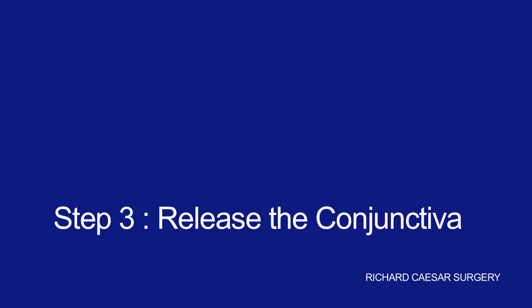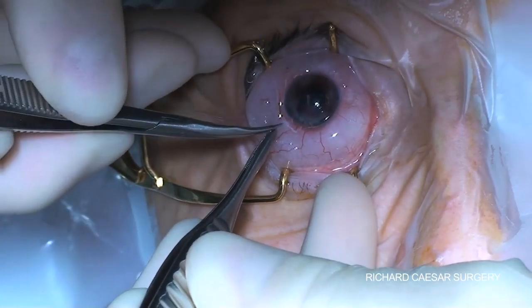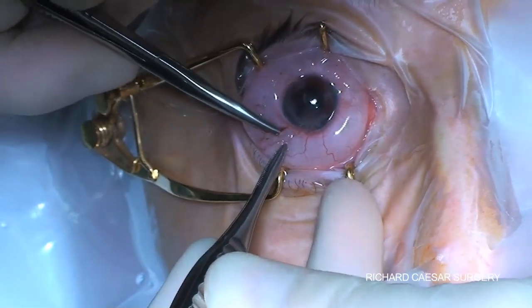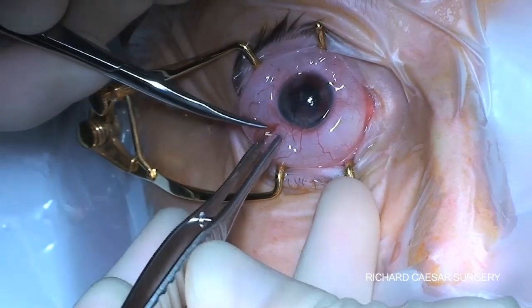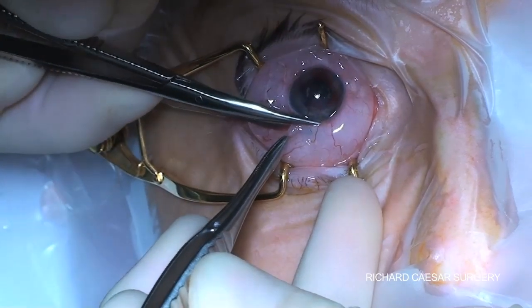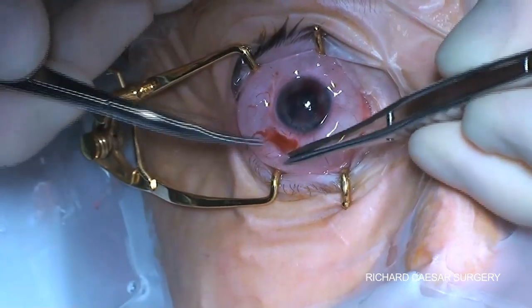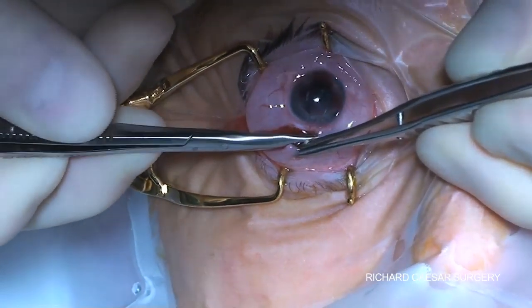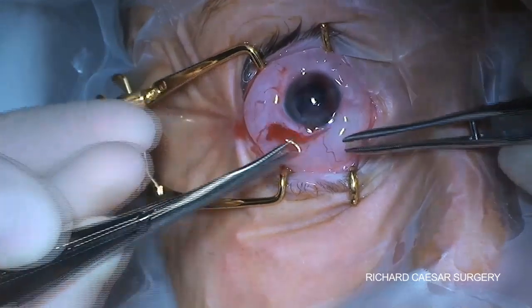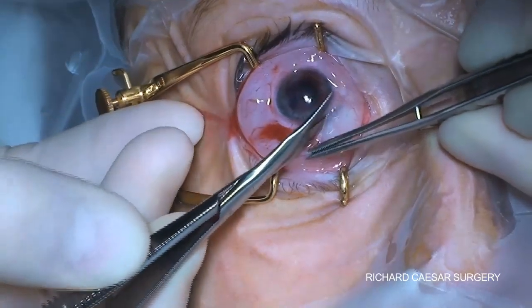The next step is a conjunctival peritomy, exactly as you would do for vitreoretinal surgery in terms of hooking the muscles, or indeed for squint surgery. A relieving cut is made. I like to make my two relieving cuts — one inferior to the lateral rectus and then one superior to the medial rectus — and then make a pocket underneath the conjunctiva and Tenon's. Bring the edge of your spring scissors as close as you can to the limbus to preserve as much conjunctiva as possible.